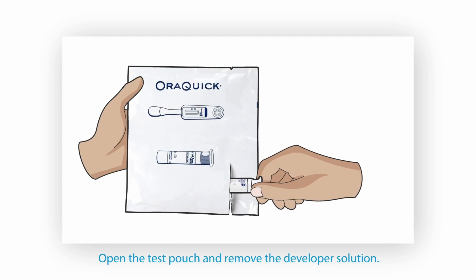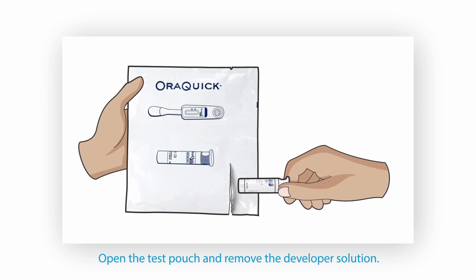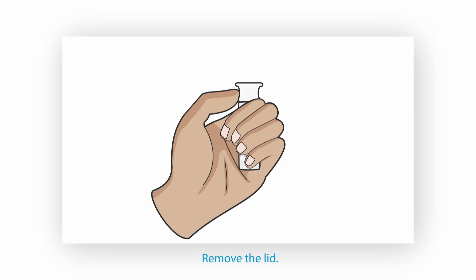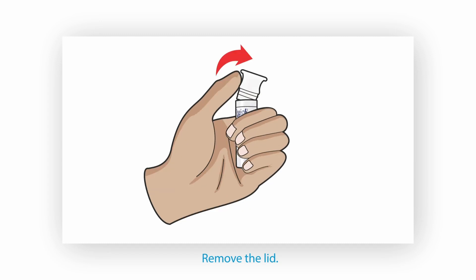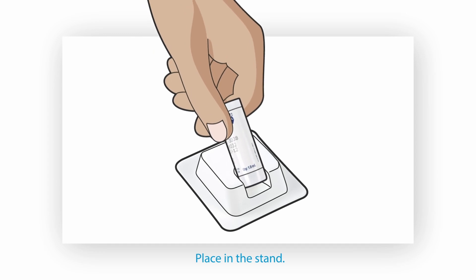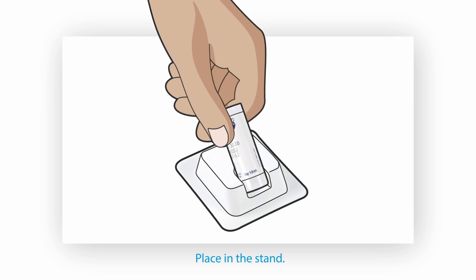The desiccant pack is for storage and is not needed for the test. Let us now go through the testing instructions. First, open the test pouch and remove the developer solution. Remove the lid from the developer solution. Place the developer solution in the stand. Be careful not to topple the solution.